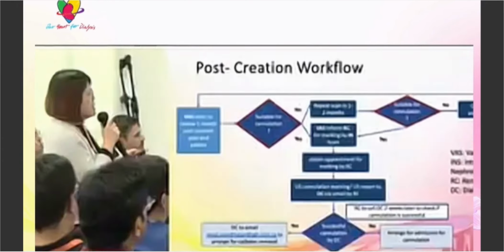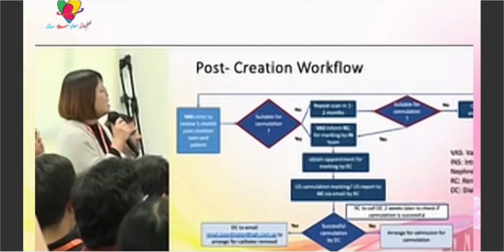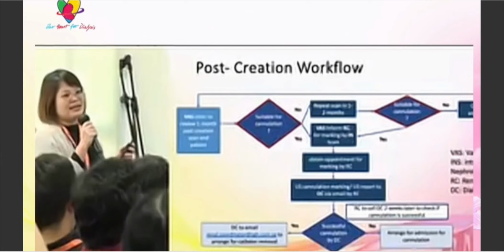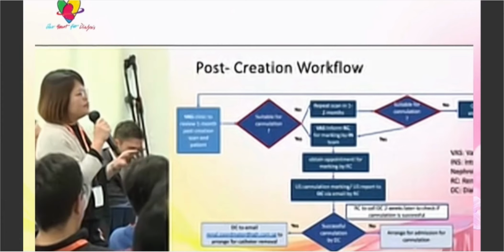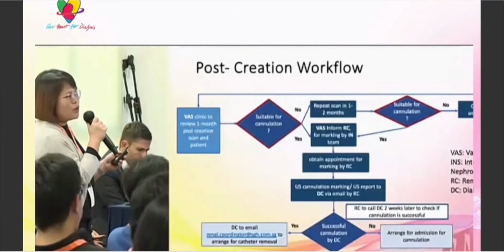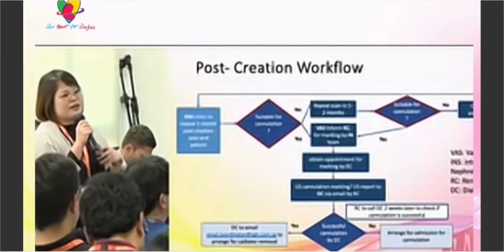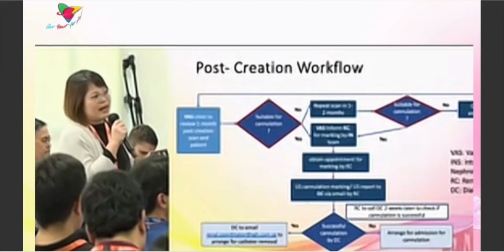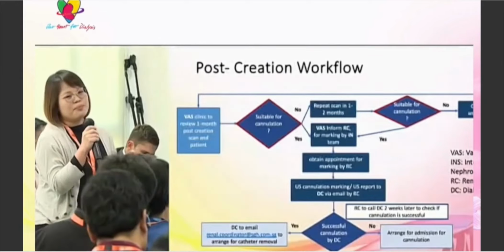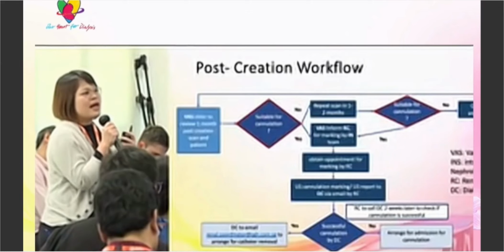And this is our protocol. We have always wanted to know if this is a fistula that can be cannulated. So you could see there is a series of workflow that involves our coordinator, our surgeons, the VSU, and getting an arrangement in terms of angioplasty. In some scenarios where they had a problem with cannulation, we bring them in as inpatients and do it by one of the team, usually under ultrasound guidance and using plastic cannula.